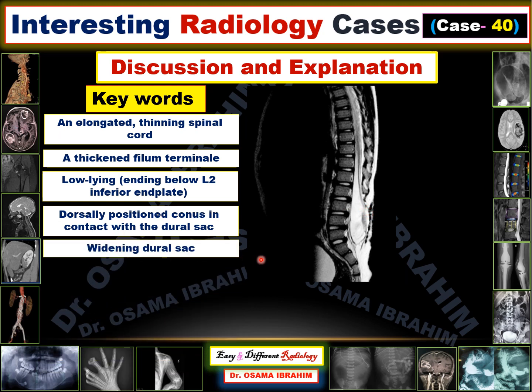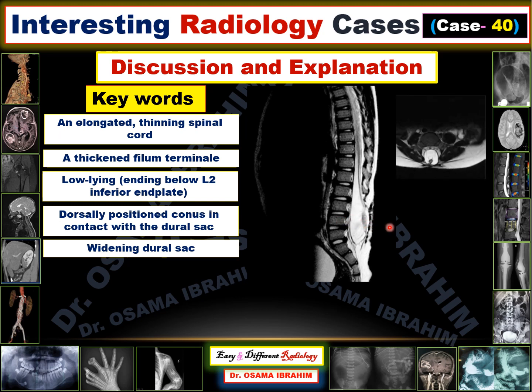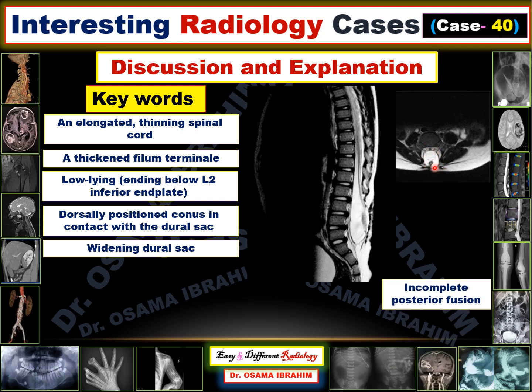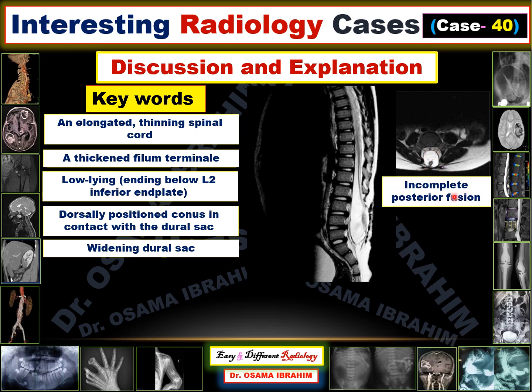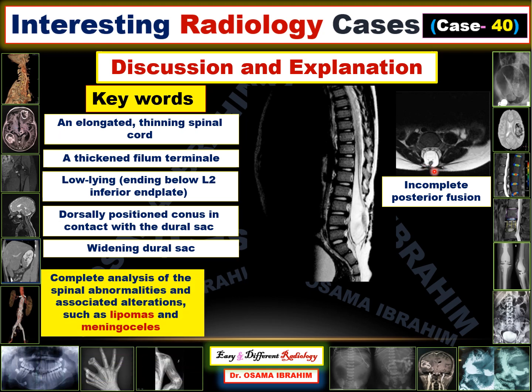There is widening of the dural sac. Look at that widening compared with the proximal part of the dural sac, which appeared normal. There is widening here of the dural sac, meaning there is a pulling defect resulting in this widening. The axial image also confirms this widening of the dural sac, and there is incomplete posterior fusion of the vertebral body, representing spinal dysraphism.